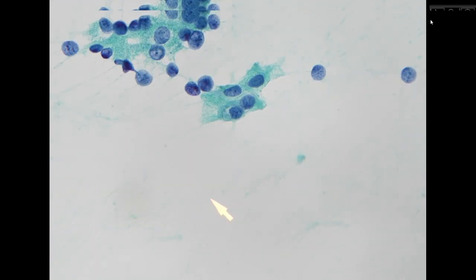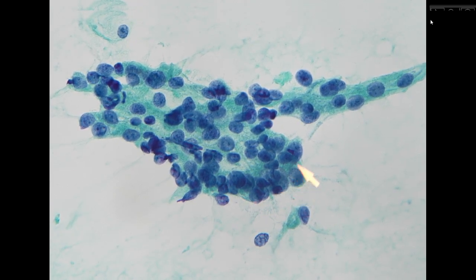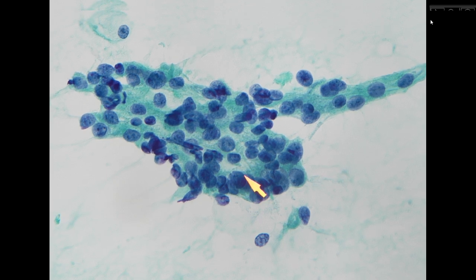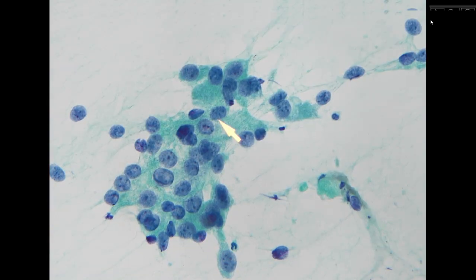So we have a lot of these clusters. Most of the clusters are cancer cells. So this is easy for the diagnosis. Here again, we have very overlapping cells, and here they are very distant from each other. The cells show hyperchromasia and a little bit coarse chromatin, although the nucleoli are not very prominent, but because of this degree of disorganization, along with the chromatin change, this is still consistent with adenocarcinoma.